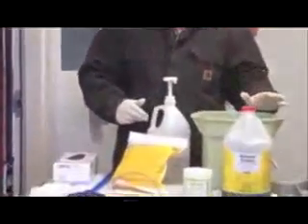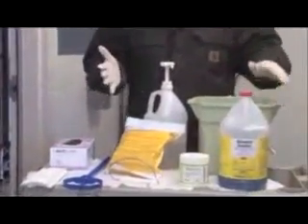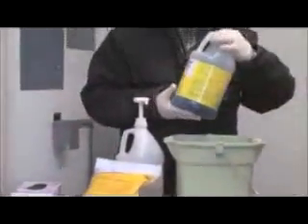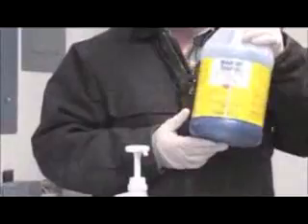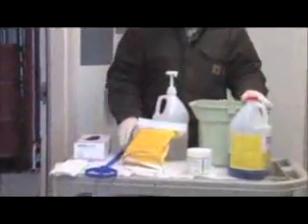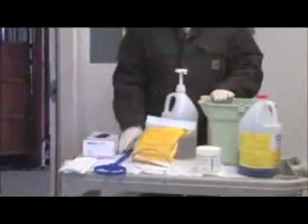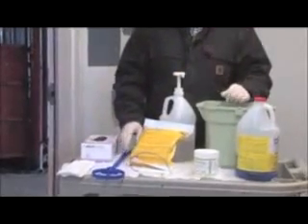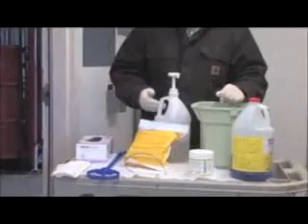Additionally, you will need a bucket of water that contains a mild disinfectant. Some of the disinfectants commonly used include Nolvisan or Ephrosan, both of which should be mixed at the recommended dilution level into the water. This allows you to clean the CIDR applicator or the CIDR gun between each cow to minimize the transfer of infection or disease from animal to animal.